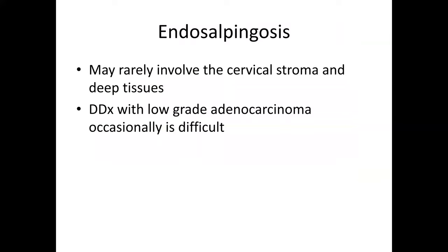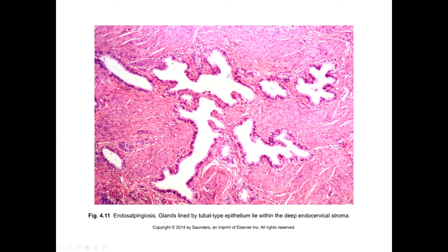Endosalpingiosis rarely can involve the endocervical stroma and deeper tissues, and of course it's benign. Differentiating it from low-grade carcinoma can occasionally be difficult, especially if there's overlying endocervical carcinoma or adenocarcinoma in situ. Here we see tubal metaplastic-type epithelium in a location not connected to the mucosa, so it can look just like tubal metaplasia but involve the deep stromal tissues, particularly common in deeper tissues.